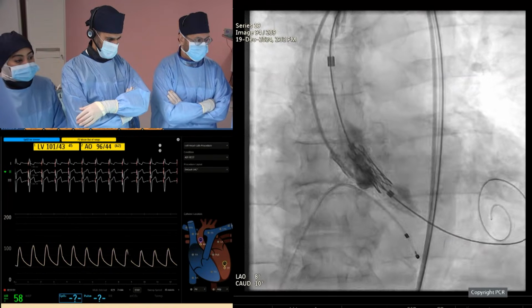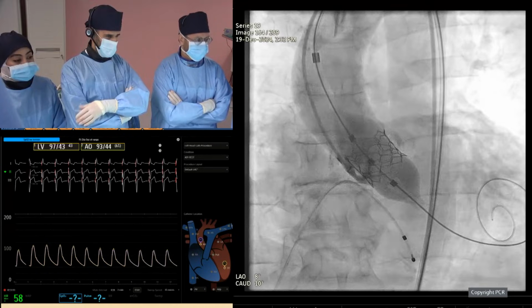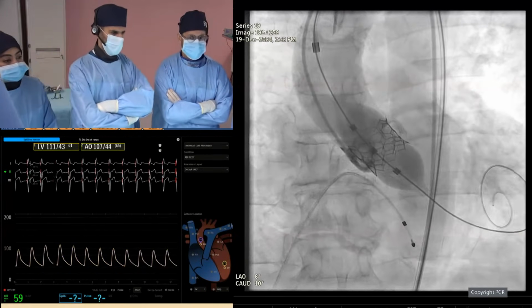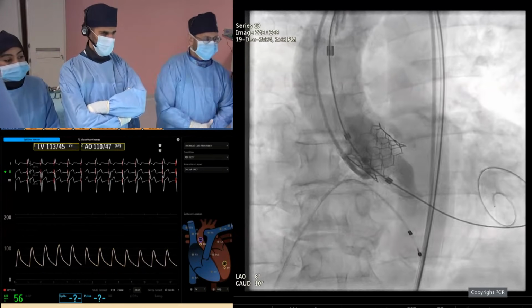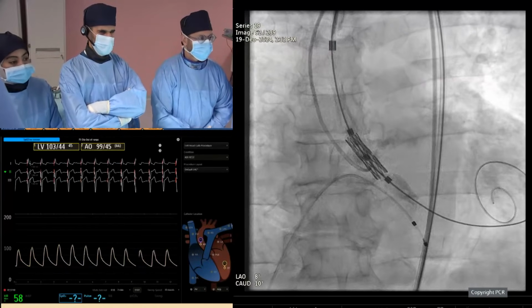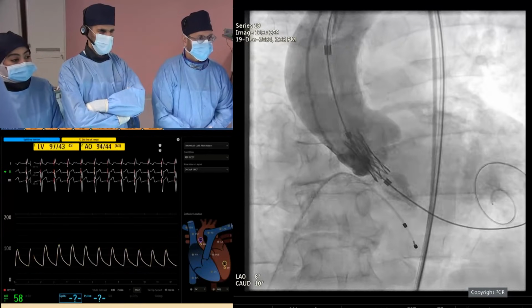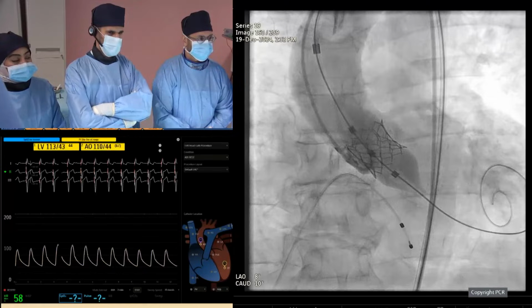I thought you did that fairly well. I mean, you don't want to give more contrast. You've got a good result. Yeah. You're not going to undo anything. Yeah, no, absolutely. So I don't think you need to give. You've got no gradients. The pacemaker, I believe, was inevitable. No. And almost inevitable. Yeah.